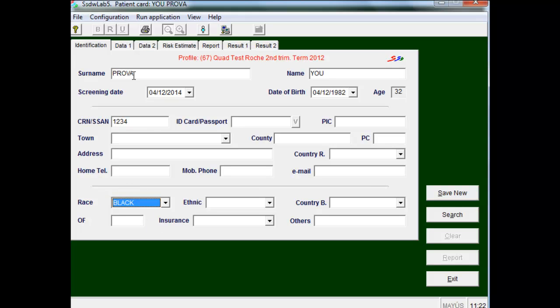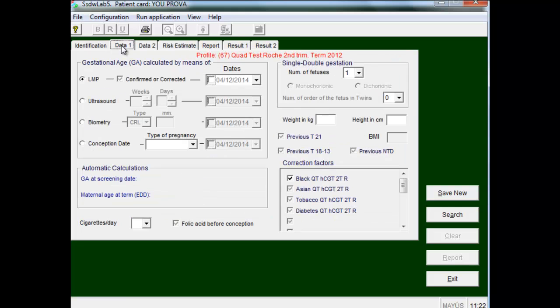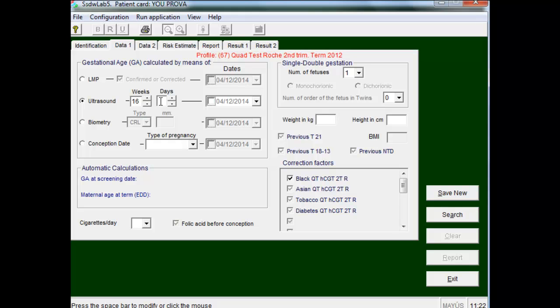In the next folder we will introduce the gestational age of the patient, and the weeks and days of gestation will appear. The number of fetuses will be a single fetus. Also we introduce the weight of the patient, that is a correction factor.